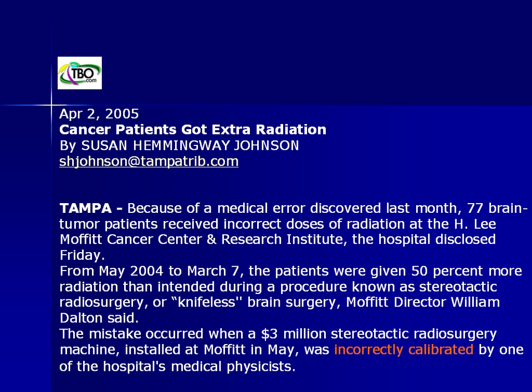This is one that happened in 2005. This is an article out of a newspaper in Florida, and this a problem that happened at Moffitt. There was a medical error discovered. 77 brain tumor patients received incorrect doses of radiation.